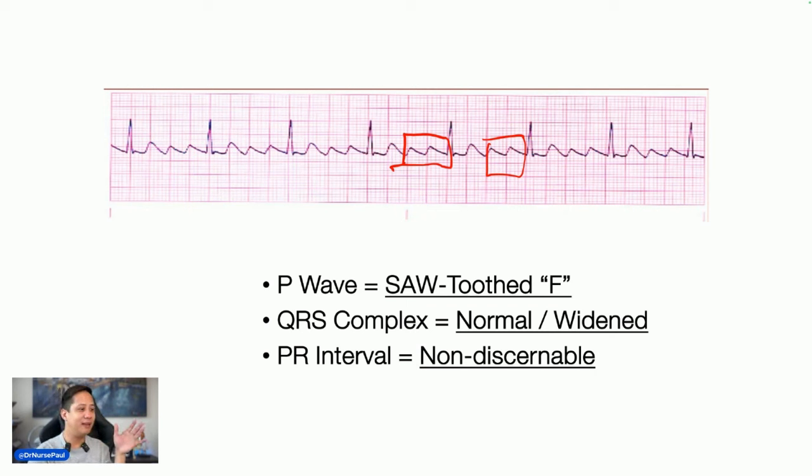Everybody. No? No. That's it. Don't sweat it out. Don't make yourself too tired with identifying. Is this PR? There's no PR. There's no P. You got it?